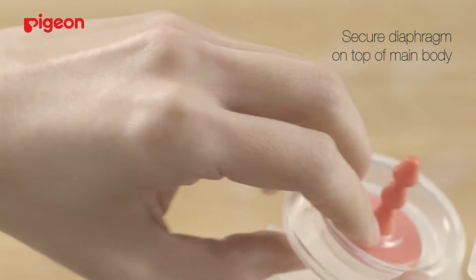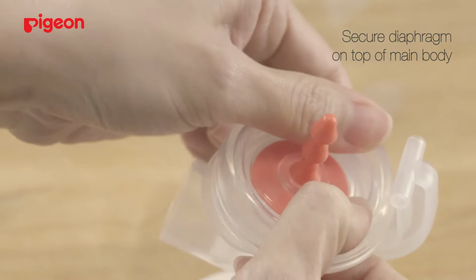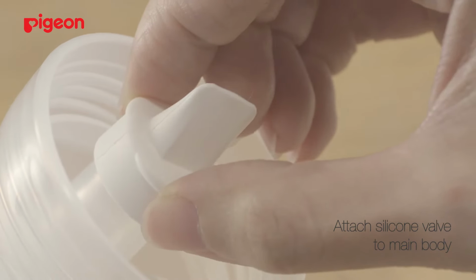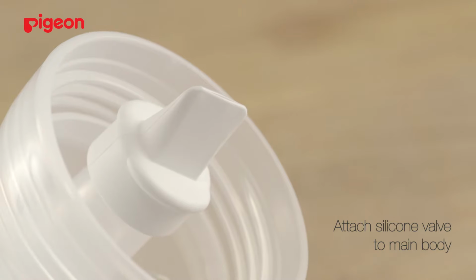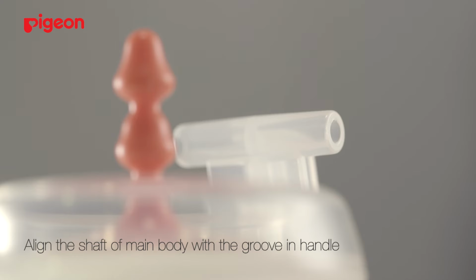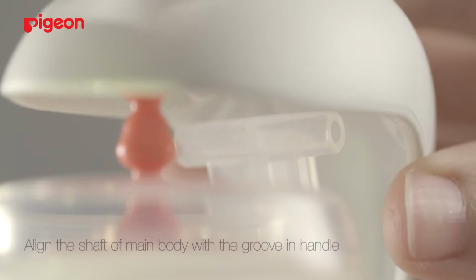Place the diaphragm on top of the main body and firmly secure it in the groove of the main body. Hold the base of the silicone valve and attach it to the main body. Screw the main body onto the bottle. Align the shaft of the main body with the groove in the handle.